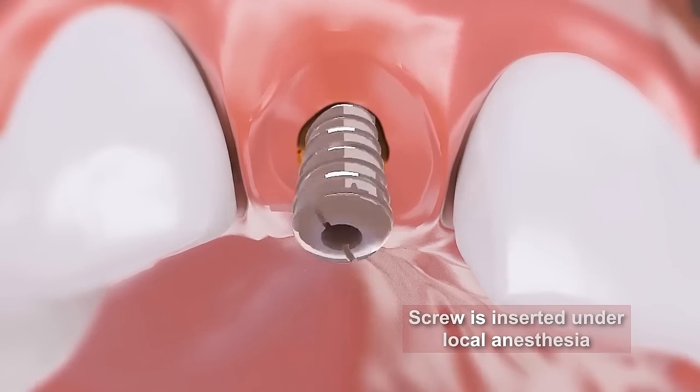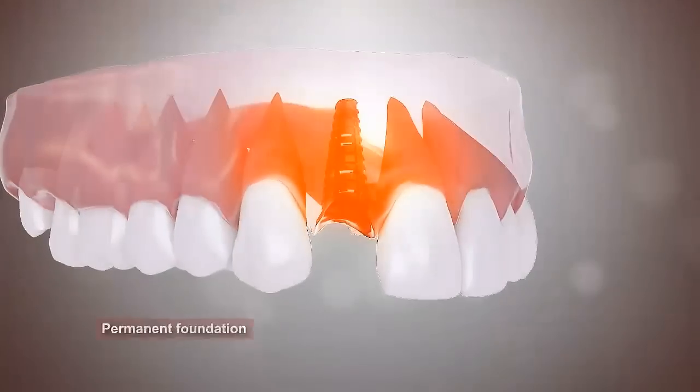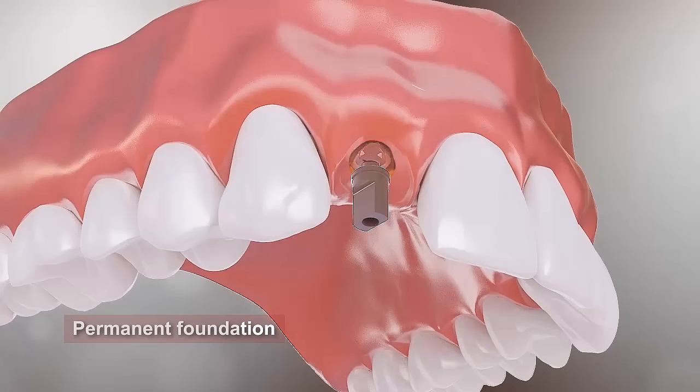When placing an implant, a screw is inserted into the bone under local anesthesia. Within a few months, this initial implant will become a firm foundation set in position, replacing the natural root.